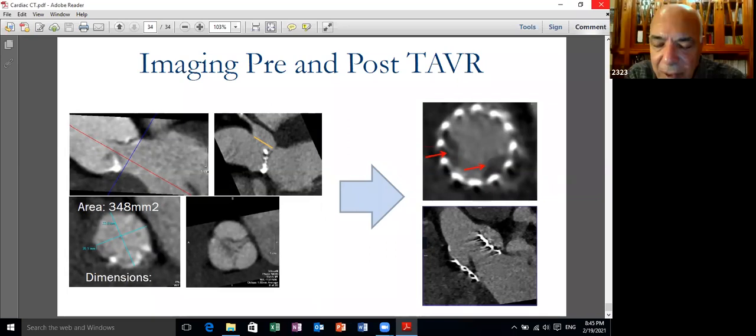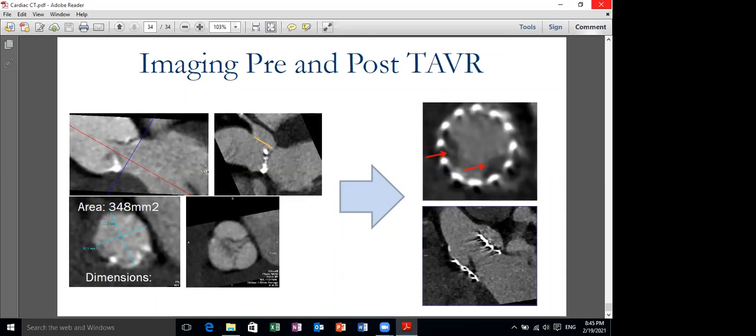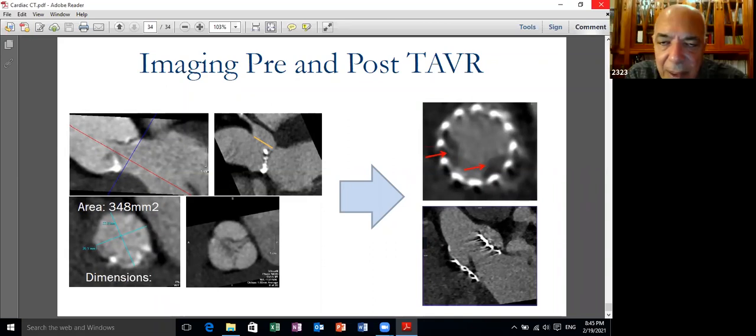Any other questions? في سؤال بيسأل can we use cardiac CT to measure aortic stiffness؟ يعني we use cardiac CT for the aorta for very large amount of information we can get. You can first of all diagnose aortic aneurysm, aortic dissection.